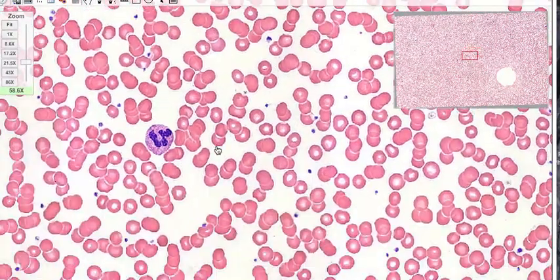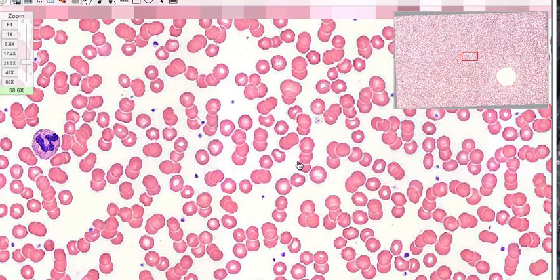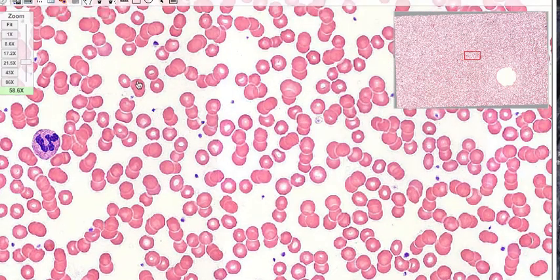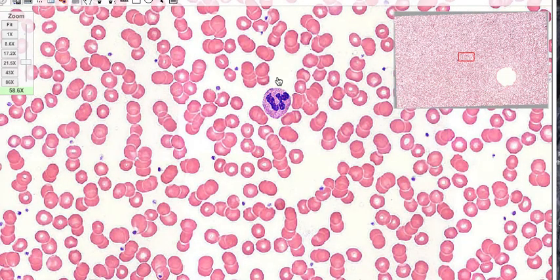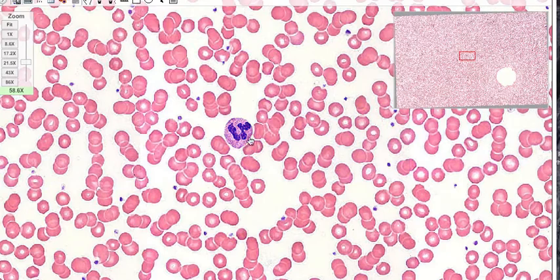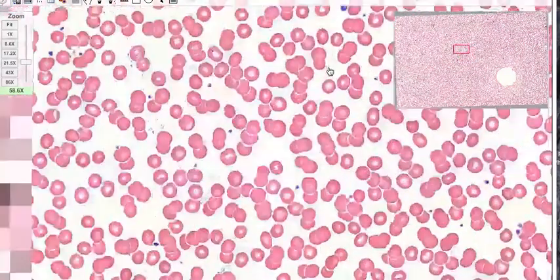So just quickly, red blood cells: no nucleus, donut shaped, lightly stained pink. Platelets within our blood form clots in response to cuts and bruises to stop us from bleeding. Neutrophils, you can't go by them. They're usually found all over the blood, a type of white blood cell.